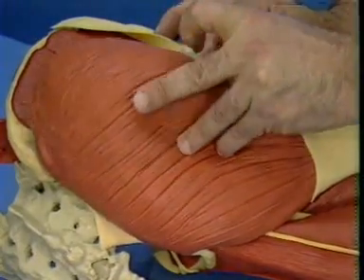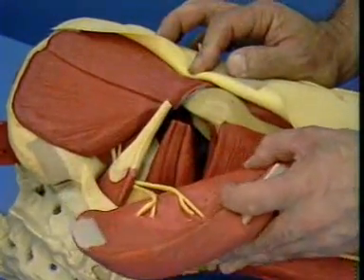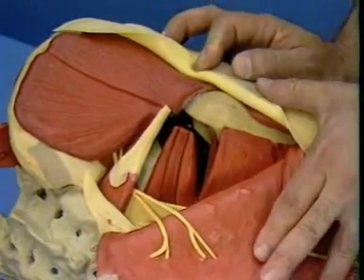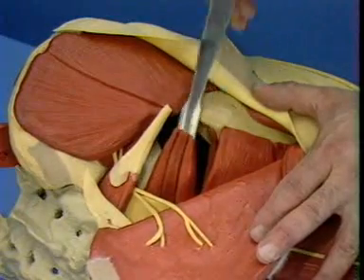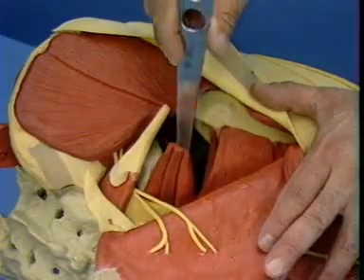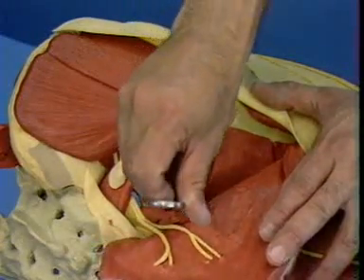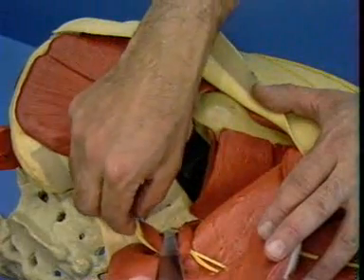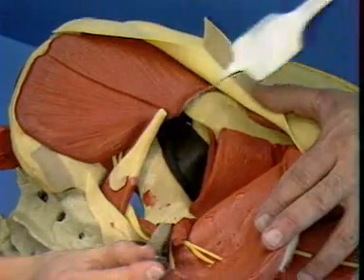The gluteus maximus muscle is reflected posteriorly. A Hohmann retractor is placed into the lesser sciatic notch, retracting the obturator internus muscle and the sciatic nerve posteriorly. The sciatic nerve must be palpated to make sure that the tension is not too great.